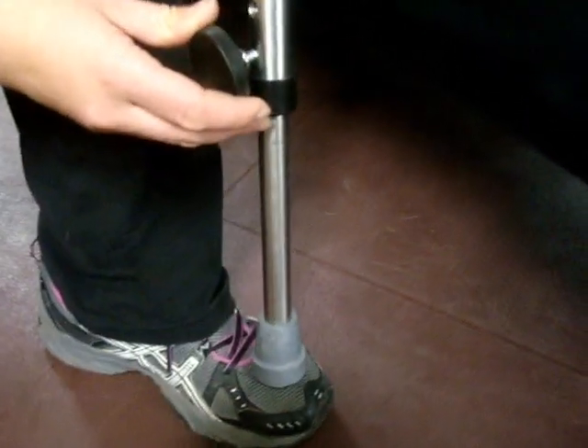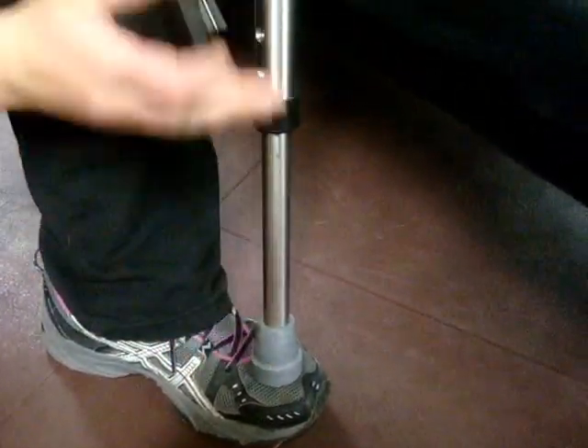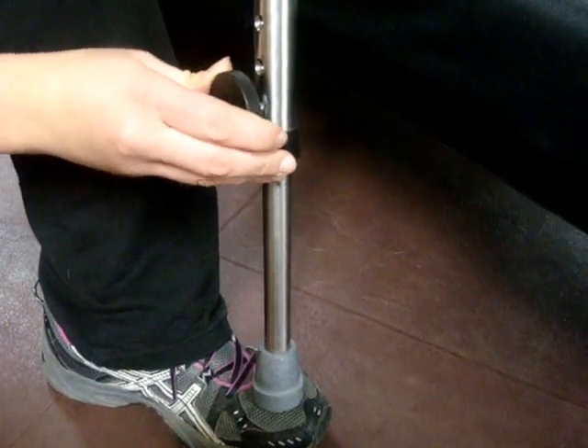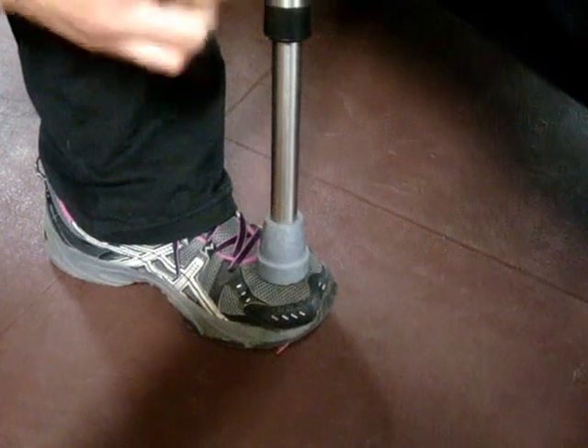The best way to make the adjustment here is to push. I usually put it on the top of my foot — the whole leg — push in the push pin, and just lift my toe slightly to slide it up so it hides that push pin.